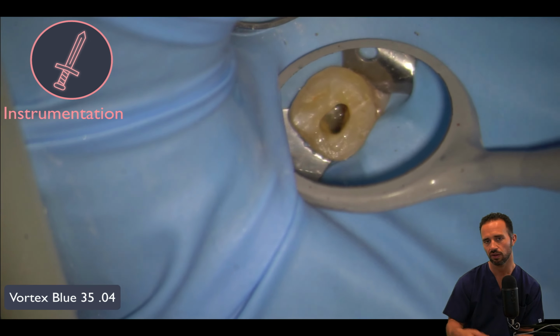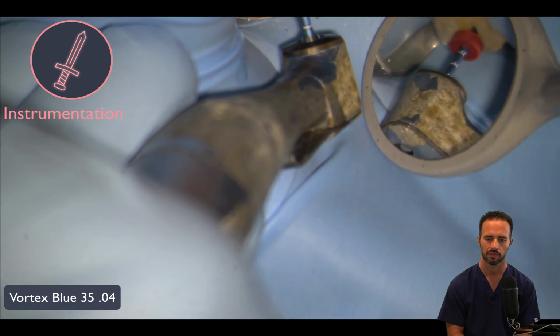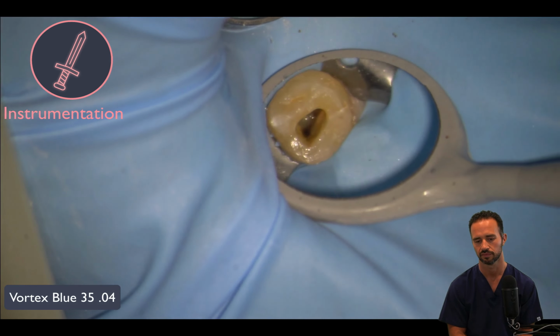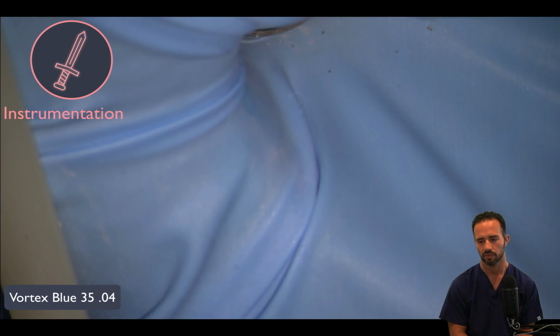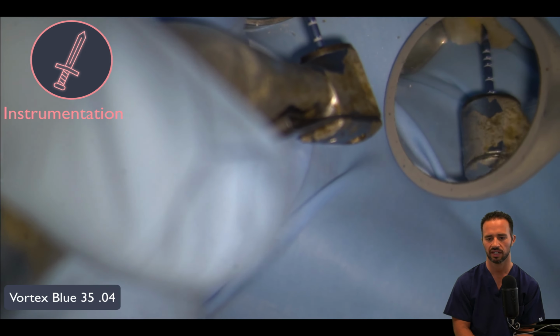And remember, on the outstroke, you want to do a slight brushing motion away from the furcation, right? A little further in the MB to get to length. There we go. We've reached length there. Wipe, load the file with RC Prep, and then back. And now in our distal buccal to 19 millimeters.